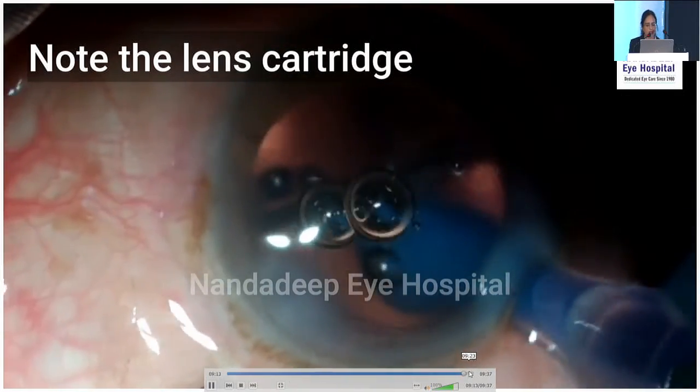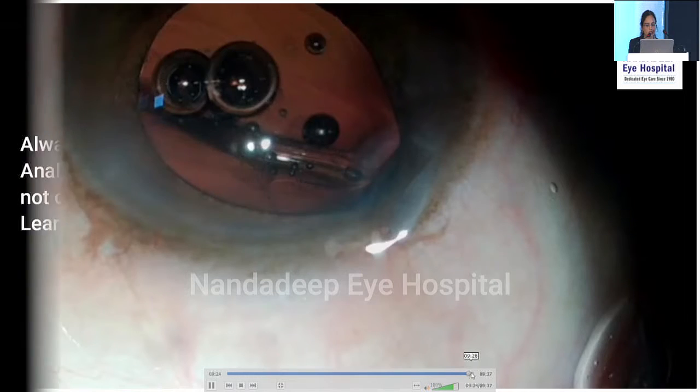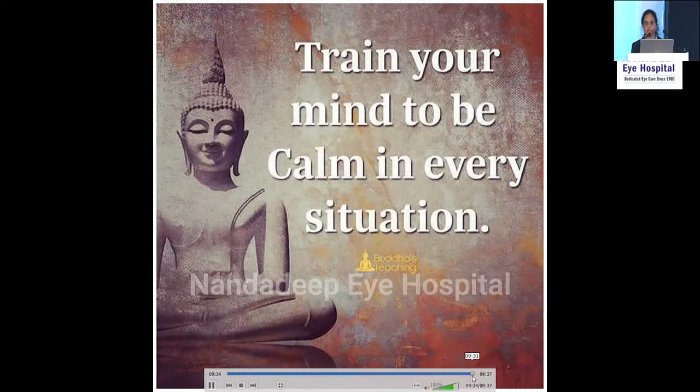So I'll just skip this last case. I'll just stress on two main important points. One thing is always record your videos and analyze your videos, because unless you know what you are doing and analyzing even your routine cases, especially in the beginning, you won't be knowing what mistakes you are doing.